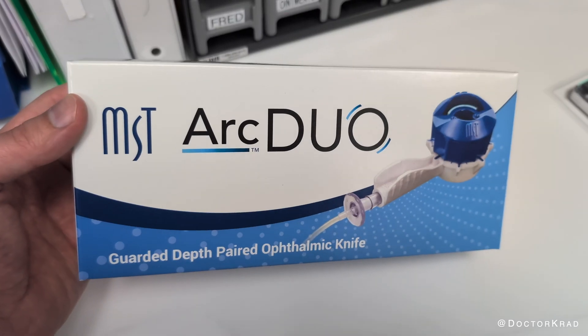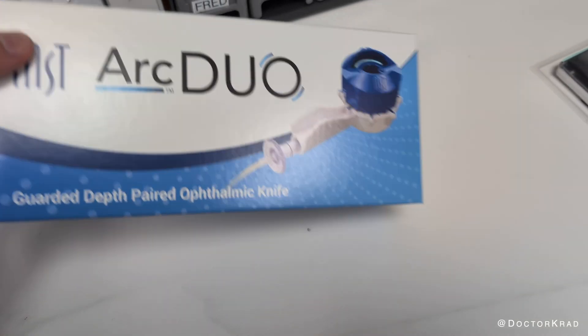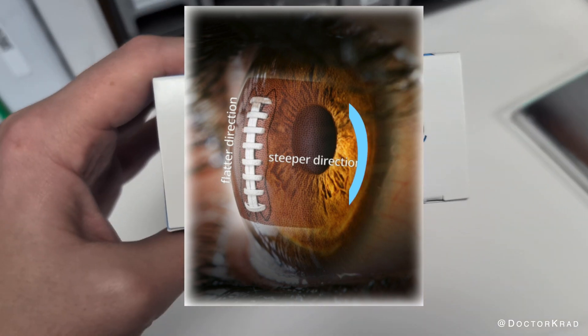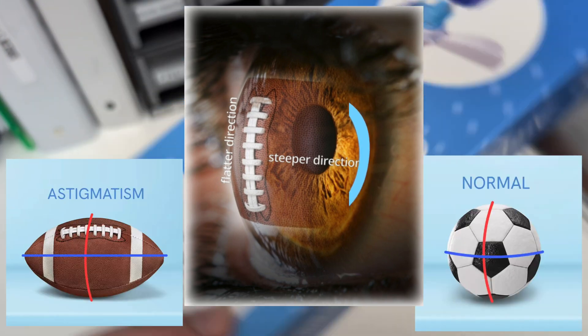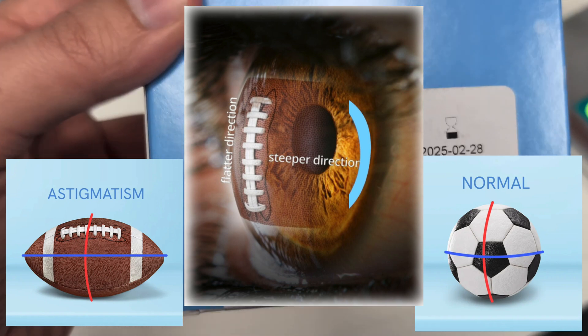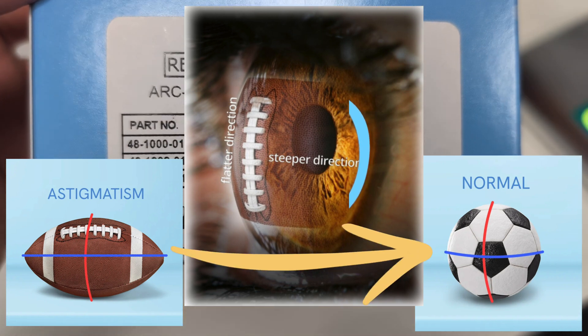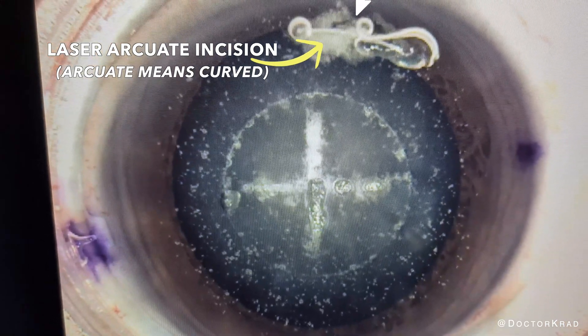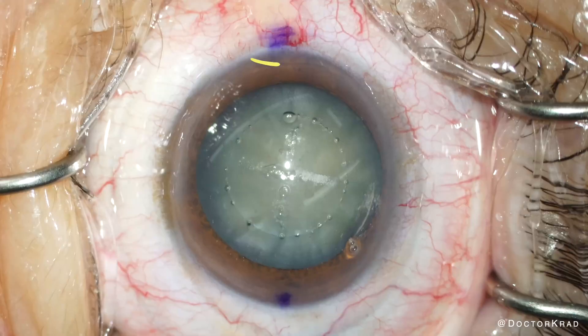Today I'm going to show you a new way to reduce a patient's astigmatism. When placed properly, LRIs reduce your astigmatism by flattening the overly steep meridian of your cornea. This results in a more spherical shape and better vision. There have been two ways to perform LRIs during cataract surgery in the past: either with femtosecond laser or manually.